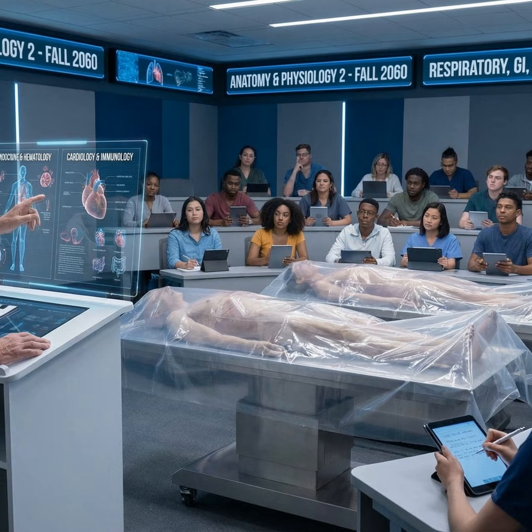And check this out. Look how cleanly this one number divides everything. For obstructive diseases, the problem is you can't get the air out. So your FEV1 is way down, and that drops the ratio below 70%. But for restrictive diseases, the problem is you can't get enough air in, so both numbers go down, and the ratio actually stays normal or even gets high, usually above 80%. Okay, so that's step 1.